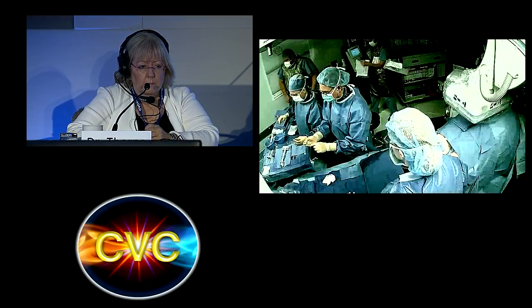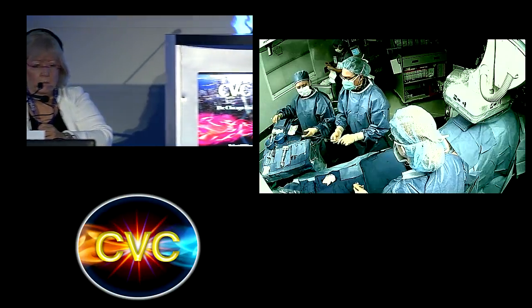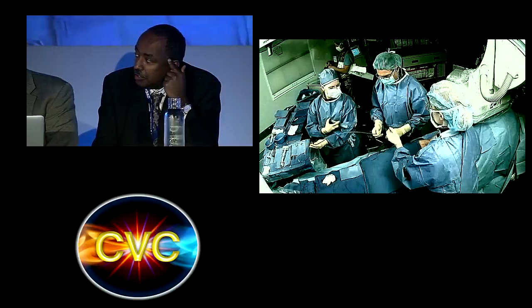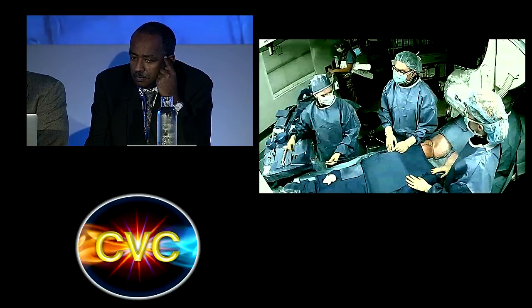I have a question. I'm still sitting on the fence on stenting across the groin. What's the harm, and this is a question to the proponents of stenting, of doing balloon angioplasty, giving a trial and seeing how the patient will do, and stenting them if the balloon angioplasty fails? I can tell you from my experience, the recurrence and reocclusion is pretty high. Since I started putting stent at that location, I think the outcome has been better, in my opinion.